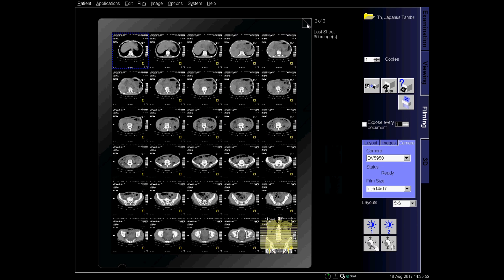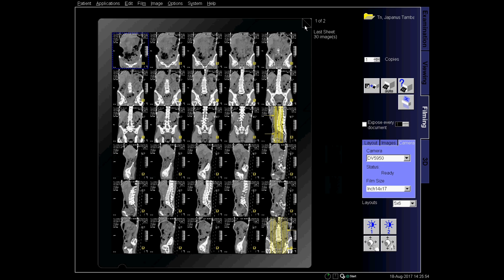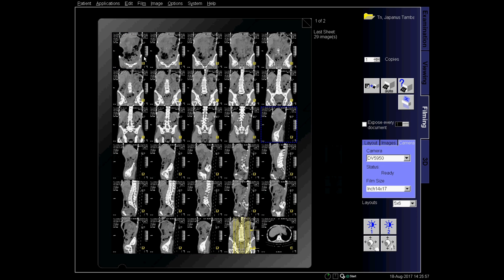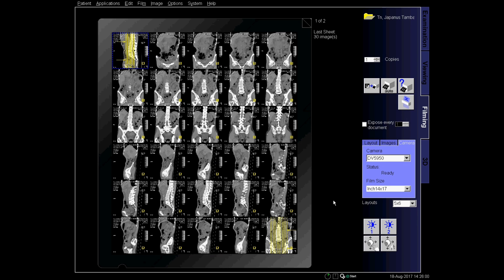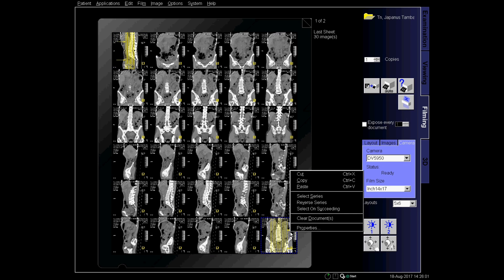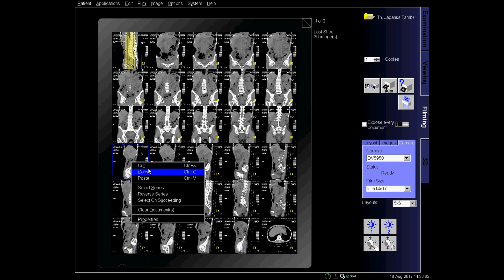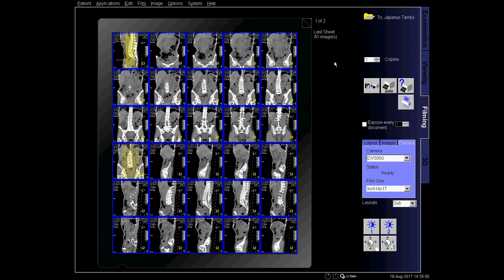Then move each topogram to be in the correct order at the very beginning of every snippet, as seen in this video. After everything is perfect, we set it up, then we do print — and that's the final result of the working process.